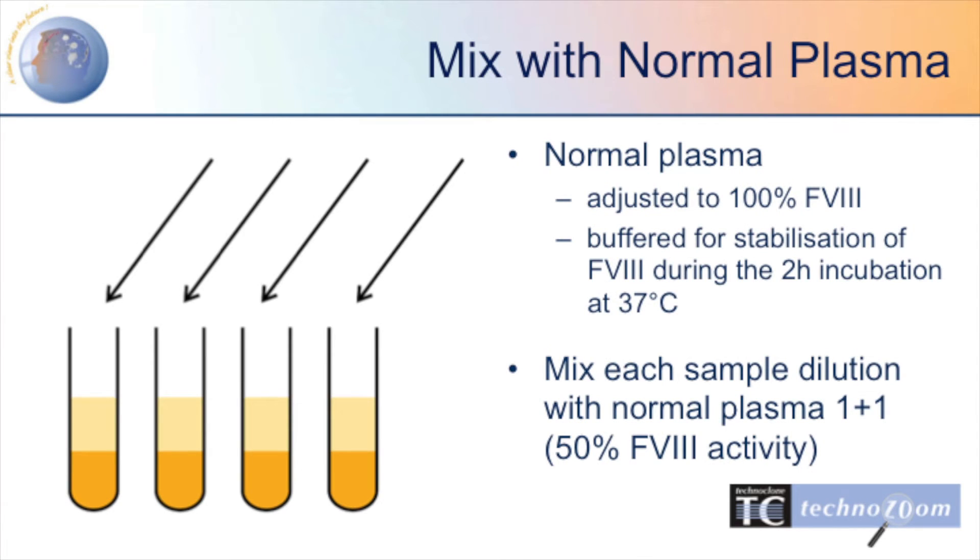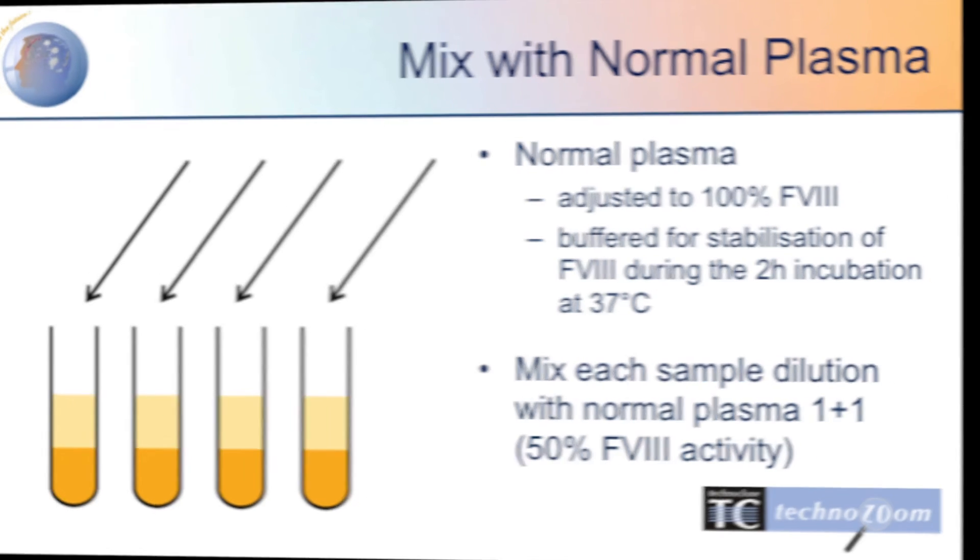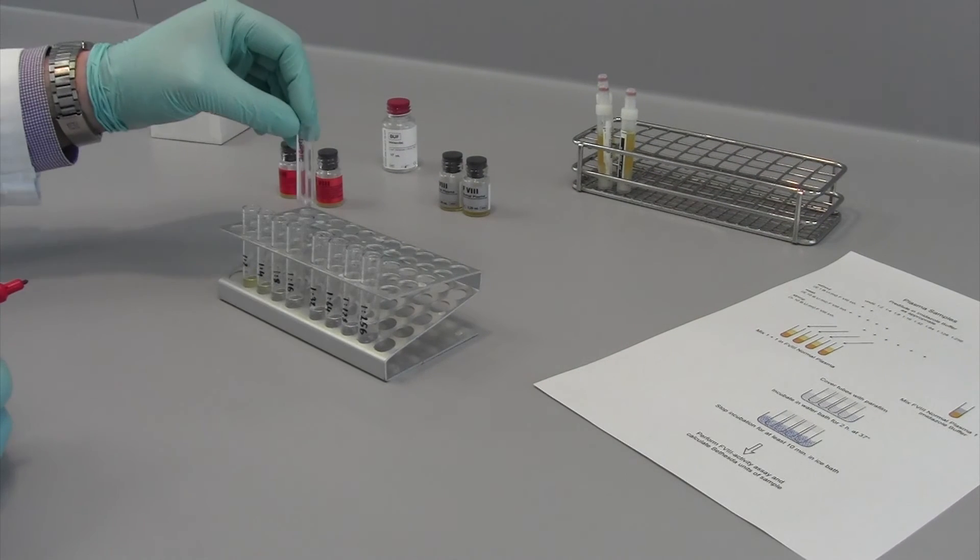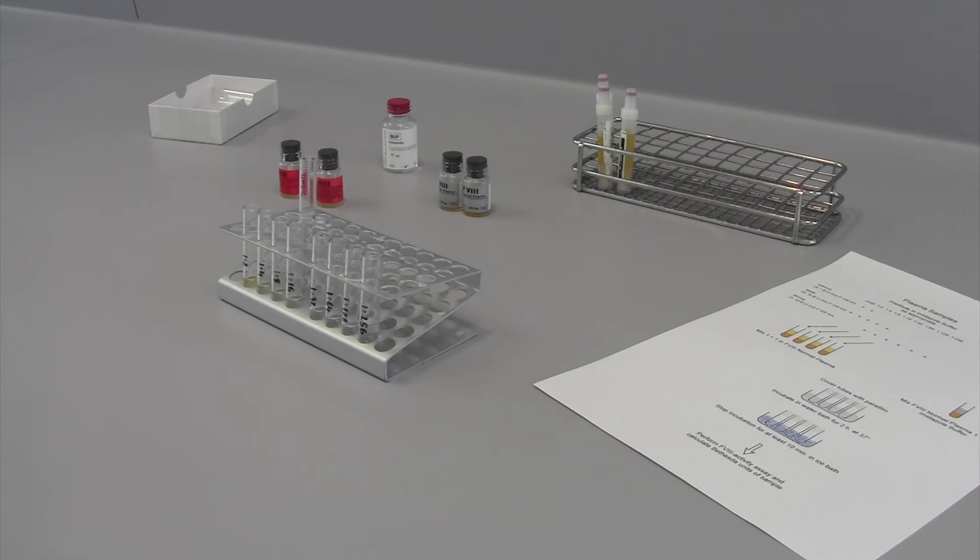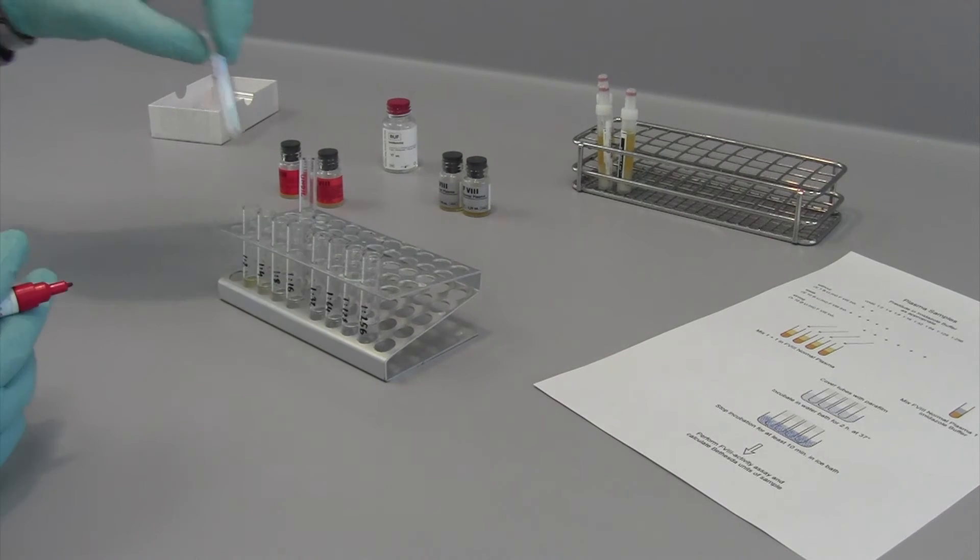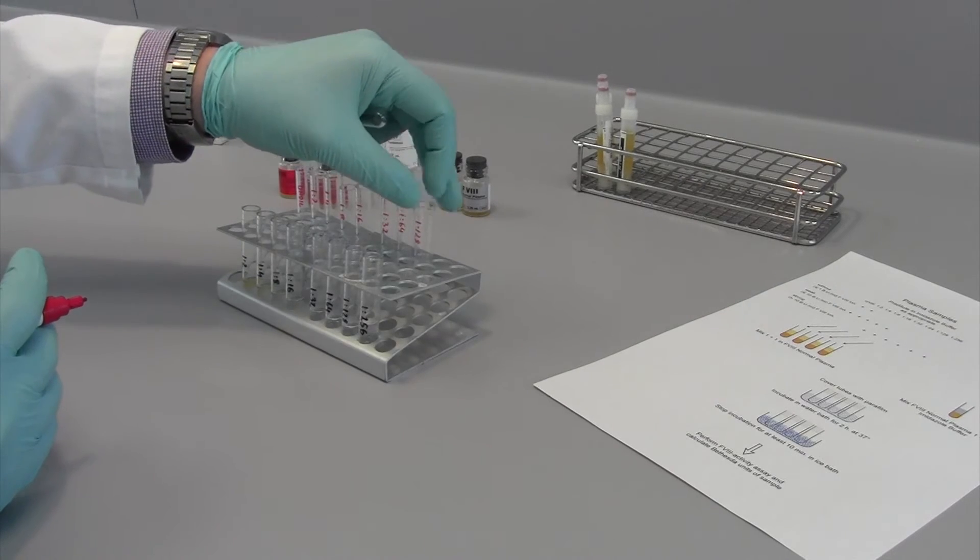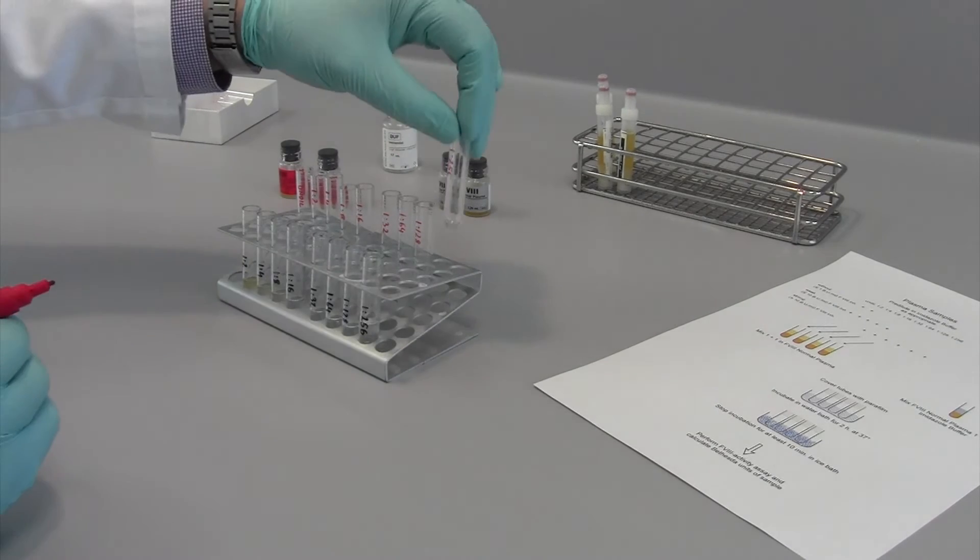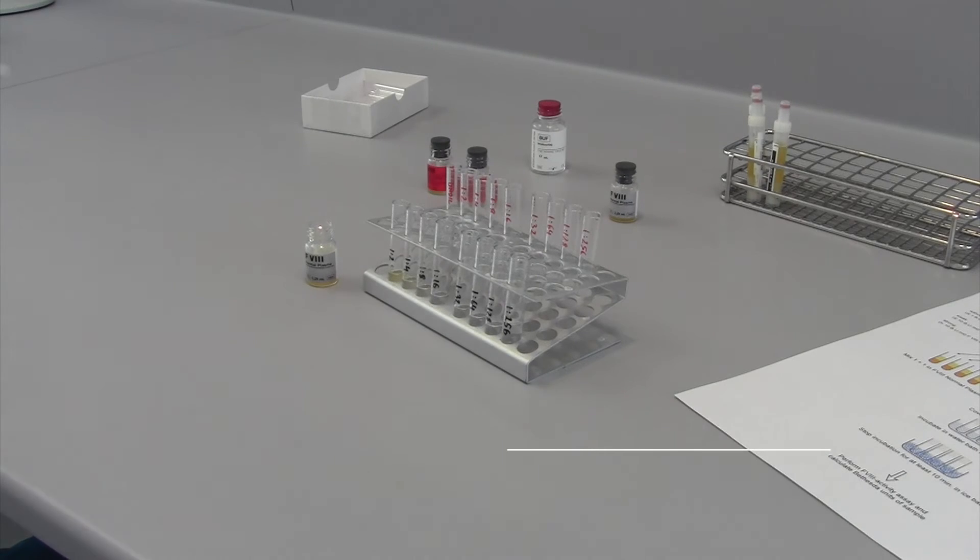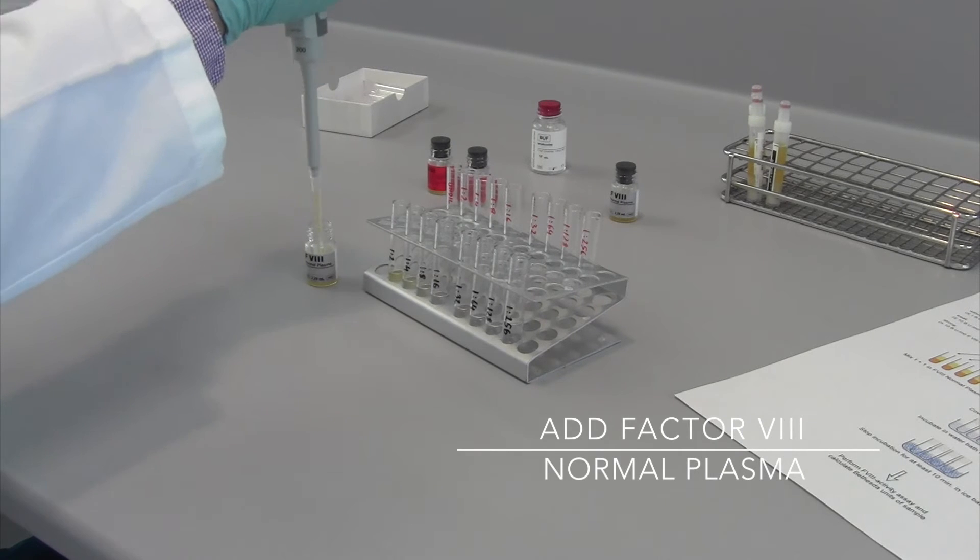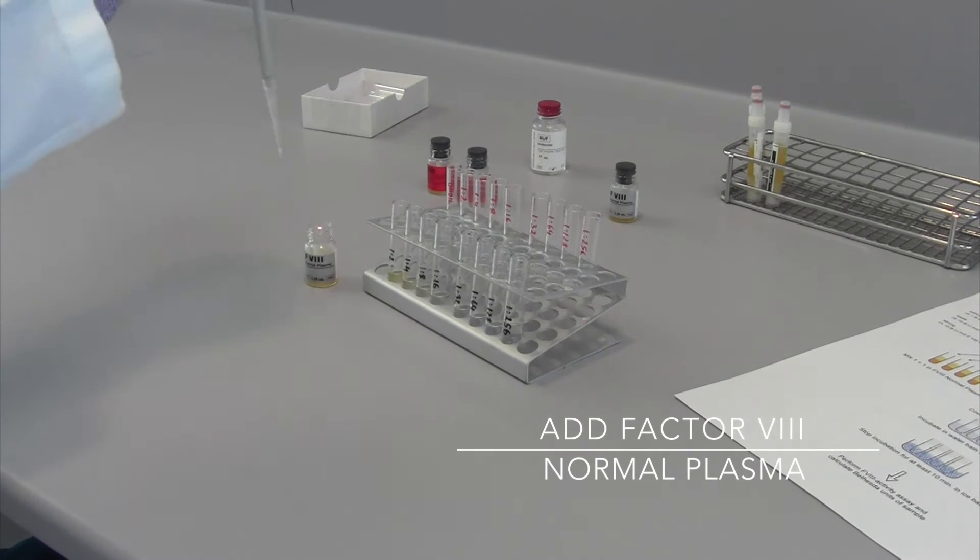We proceed with preparing the mixture of Factor VIII normal plasma. Once again, it is important to pre-label the tubes accordingly. Then, add appropriate volumes of Factor VIII normal plasma, for example 100 microliters per tube.